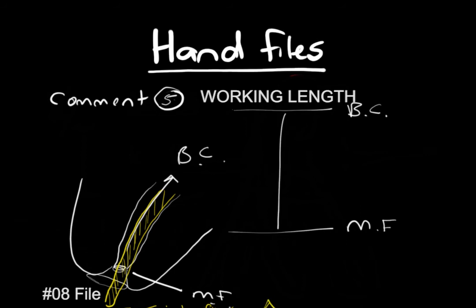Remember, it's triangular, and so it's very flexible. If you're using that, that passes literally through the minor foramen, and you don't have to pass it through there too many times. It's literally pass through, back, and make sure it's not blocked. So that was called a patency filing. Remember, rotary, irrigation, patency.